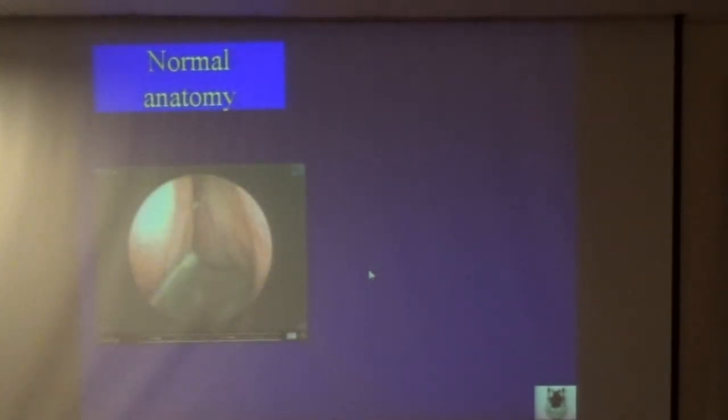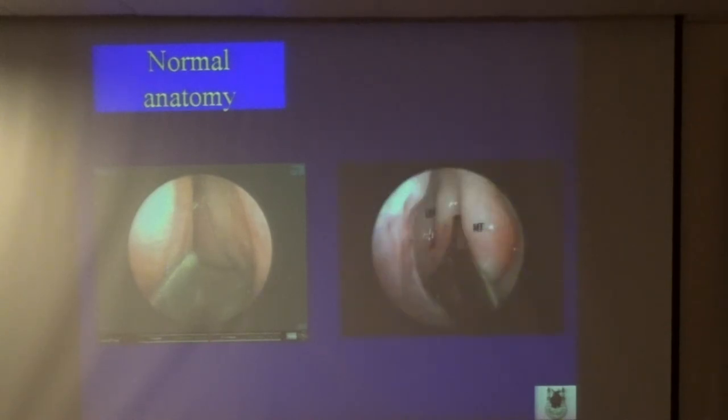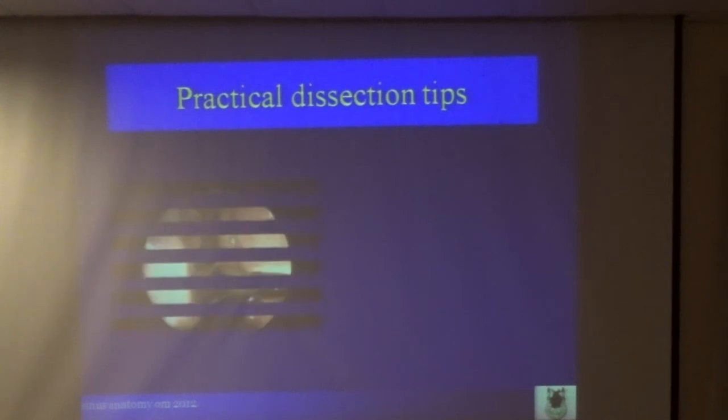So going into practical points, the first thing you want to do when you start paranasal sinus surgery is having the scope, decongesting the nose, having a great view, and then gently, 3 times, retracting the middle turbinate medially to expose the ethmoid bulla. You can use a Freer very gently to avoid cracking the middle turbinate while doing this. And by doing that, you can see different variations of anatomy.